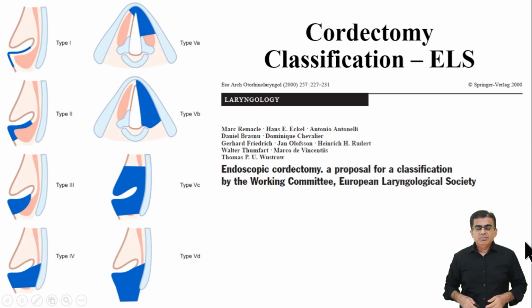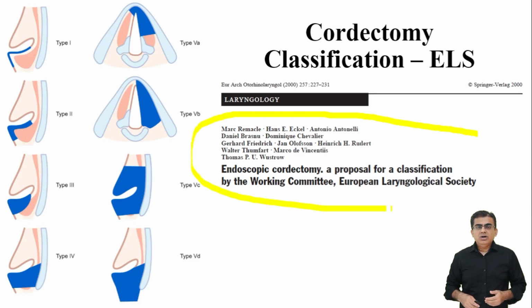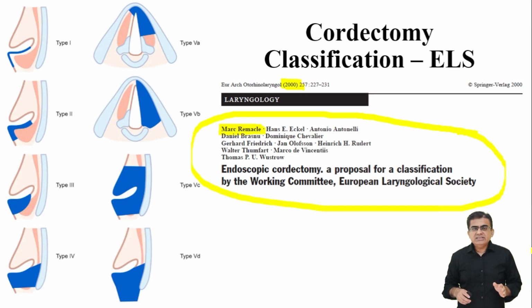Look at this landmark paper. This brilliant classification system was originally proposed by Mark Remacle and his team in the year 2000. It was later updated in 2007. This is not just academic nomenclature to memorize for your exams. It is your exact surgical roadmap in the operating room.